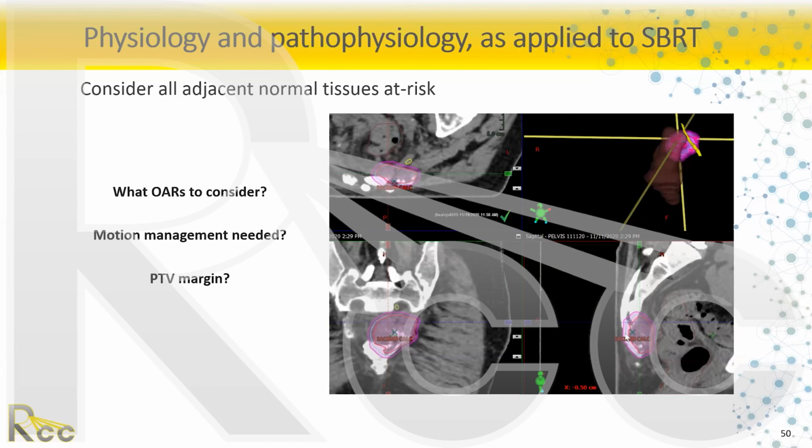PTV margin, secure setup. Patient's not going to move if they're compliant. We monitor them with that surface monitoring software I mentioned. So this is just 3 millimeters PTV margin. I felt comfortable that we could keep it within there.